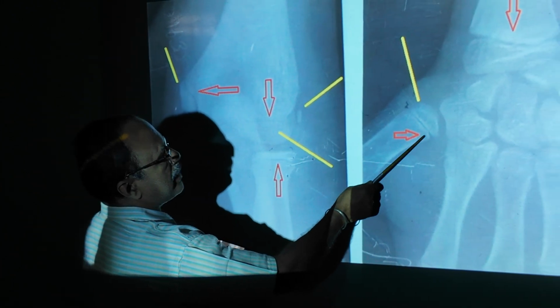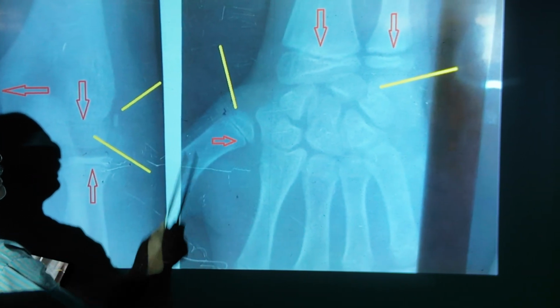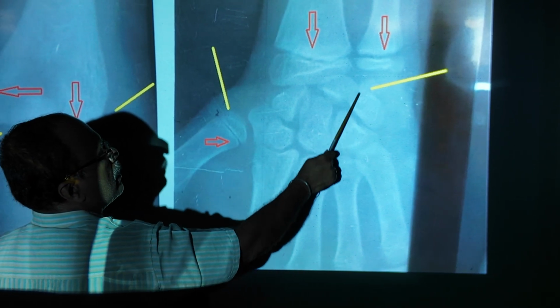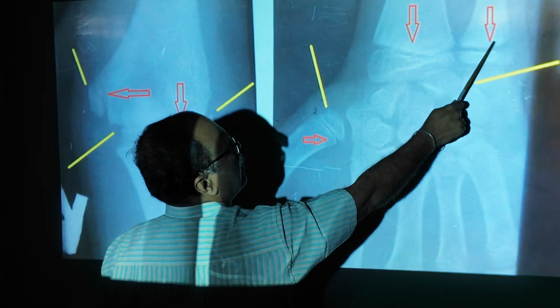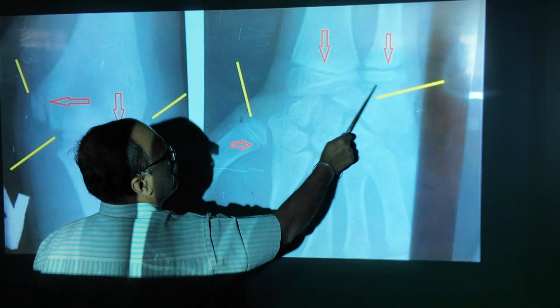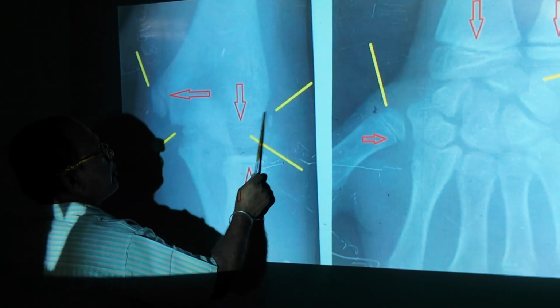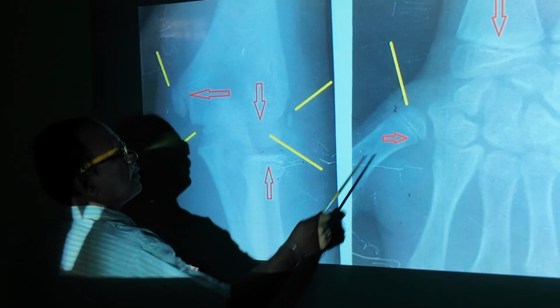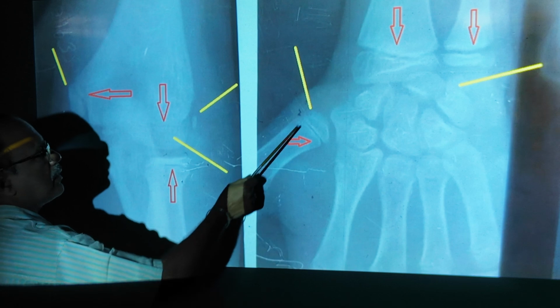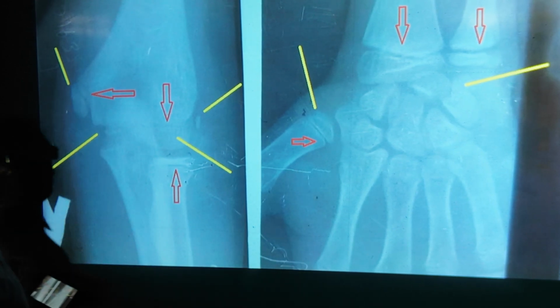Base of the first metacarpal bone not fused means less than 15 years. We can expect pisiform bone here. This is pisiform bone, lower end of ulna, lower end of radius. Pisiform bone appeared by 12 years. Lateral epicondyle appeared by 11 years. Base of the first metacarpal bone is not fused, less than 15 years. Age is 12 to 15.